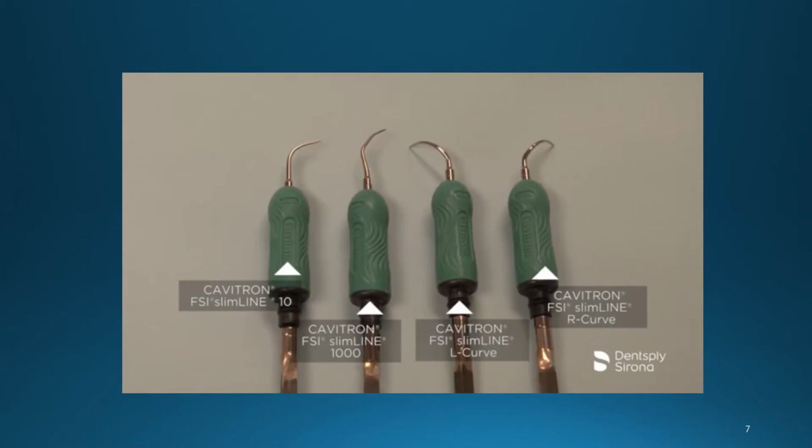Following an initial gross debridement, the clinician will follow through with a finer debridement to ensure removal of lighter calculus, remaining biofilm, and endotoxins. The Slimline series are designed to be utilized for patients that present light to moderate calculus and tissue topography and/or pocket depth which call for a slimmer diameter insert for access.